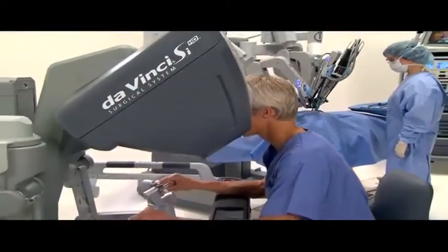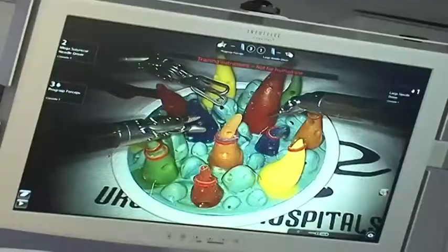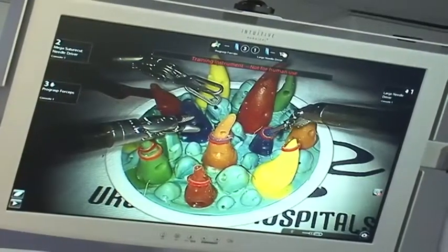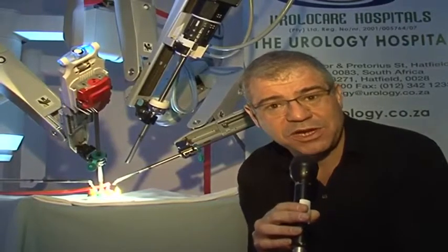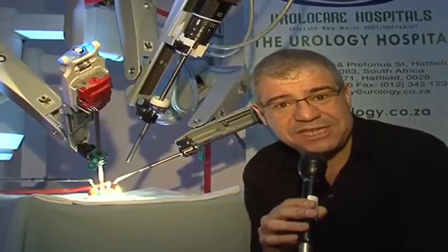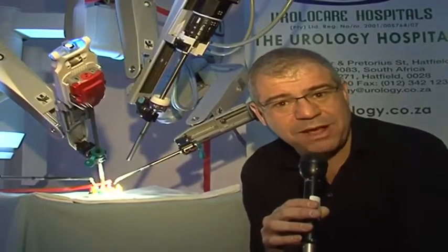Intermittent. Well, as you can see in the background, the doctor is sitting in another room operating on a patient, and what you're seeing over here is magnified by 10 times in the doctor's eyes. And these robotic arms are doing all of the work with a great deal of precision. This is the Da Vinci surgical system. One of 3,000 robots like this of its kind around the world, the first one in South Africa at a cost of 17 million rand. This is the future of surgery. It's all about robotics.